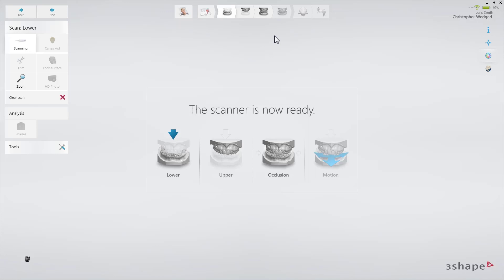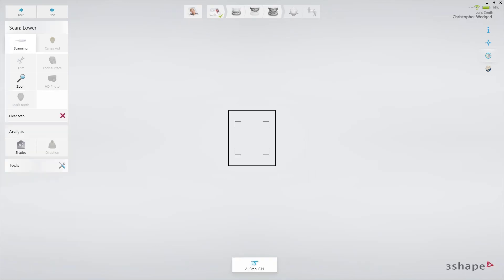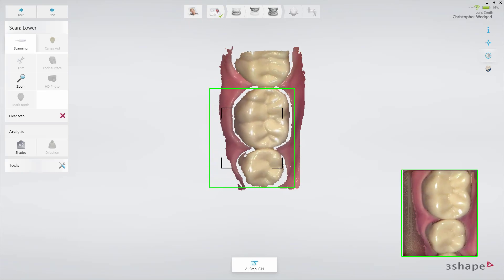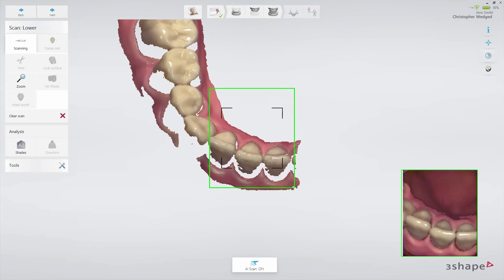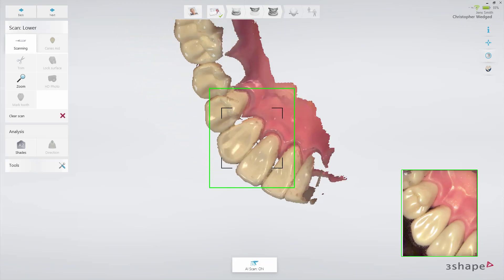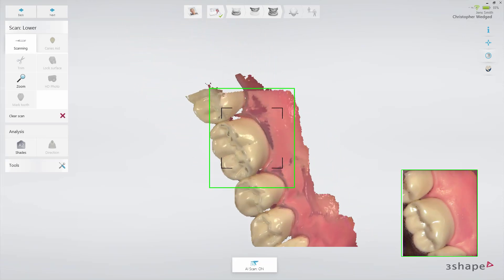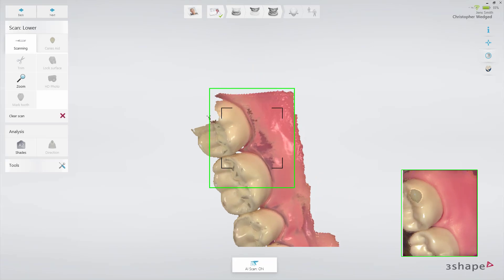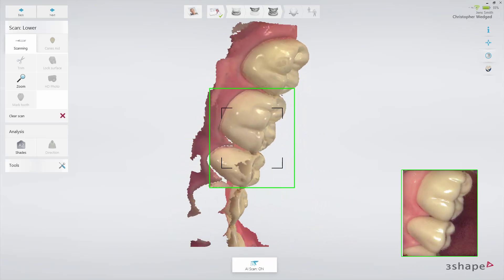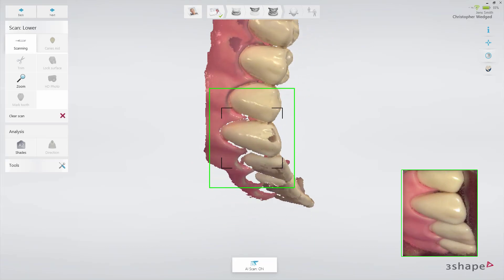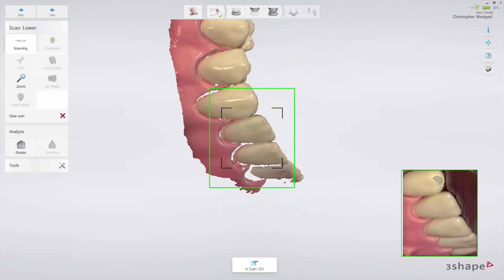As the preparation is on the upper arch in this particular case, start by scanning the lower arch. Follow the official scan strategy: start by scanning the occlusal surface from the molar to the canine. Then, as it is the lower arch, slowly roll to the lingual side and move the scanner in the distal direction. Finally, slowly roll over the last molar and scan the buccal side.